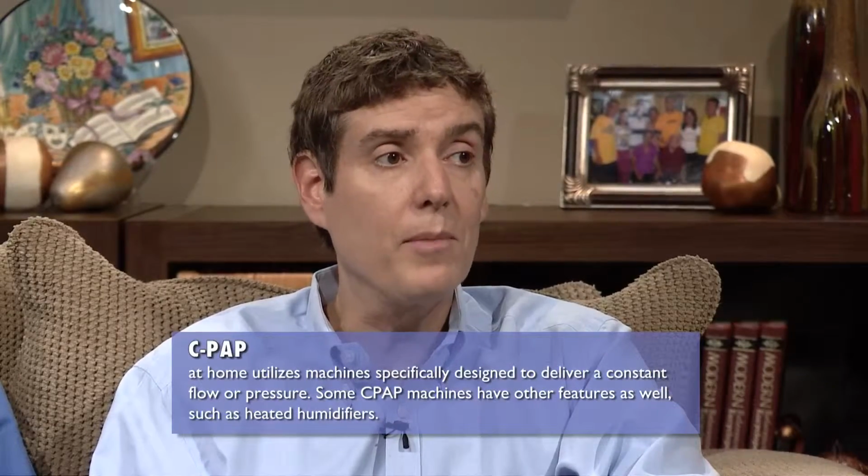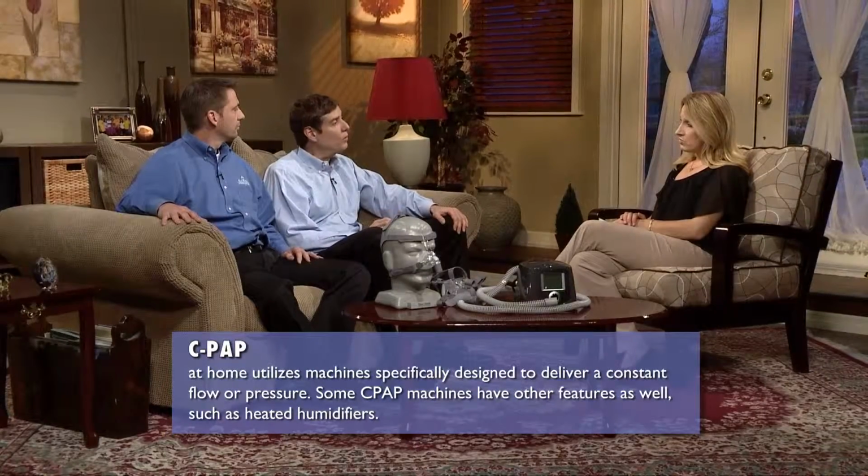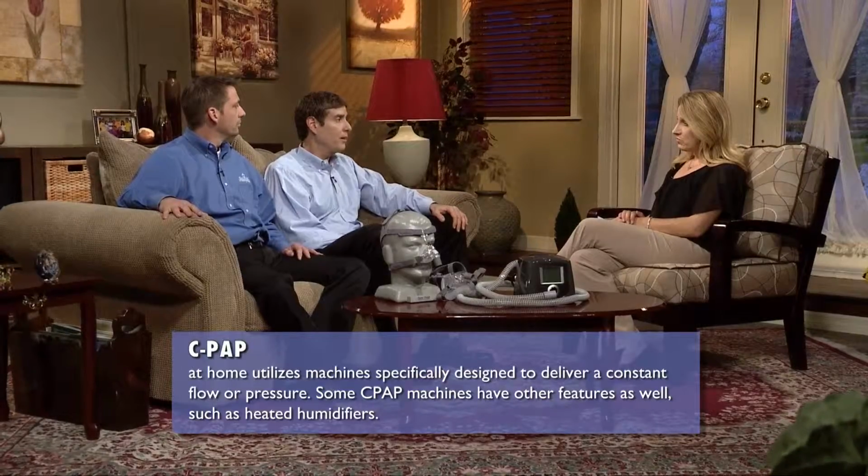A key feature for any CPAP is a heated humidifier. A heated humidifier just puts more moisture into patients' airways while they're using the device, because the airflow is a little higher than normally what we breathe when we sleep, and the patient can become very uncomfortable and not want to use a CPAP. So the heated humidifier is a key component of it, and also a heated breathing tube. There's a little heated wire within the tubes that'll help increase the level of moisture content the patient receives.